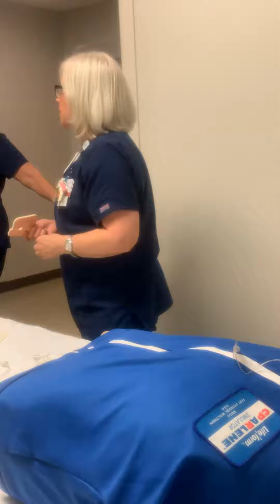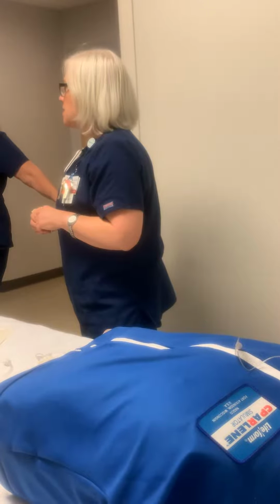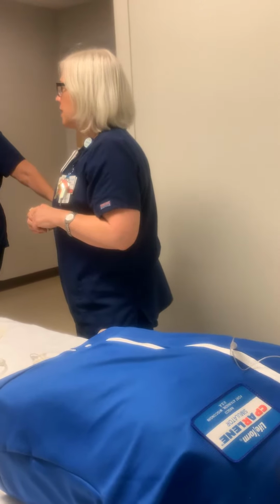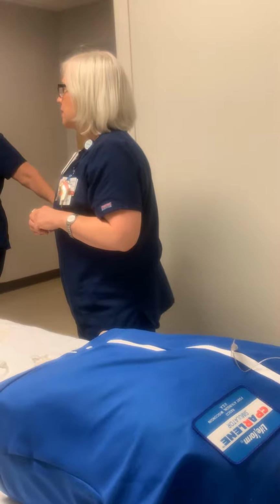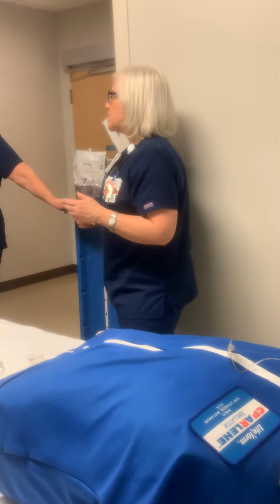I don't think this was sutured, no. But honestly, he's done treatment and it was real awful around here. And the family said, well, the doctor said we can't loosen this up. It needs to stay super tight. And I couldn't even get a flat gauze under there, a drain sponge. So unfortunately, they'll probably break down, and that's what we're seeing at Gateway a lot.